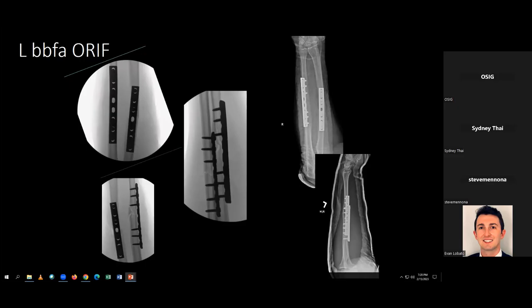Are those plates just on there, or are they pushing against the fracture? Great question. So that's a big topic. You may or may not have heard of these special plates called LCP plates, DC LCP plates, which basically means that if you look at the holes in the plates, if you imagine plates which are rectangular, let's see if I can make this really M1 level.